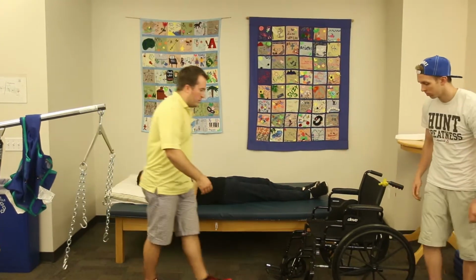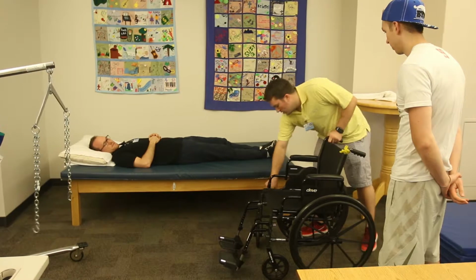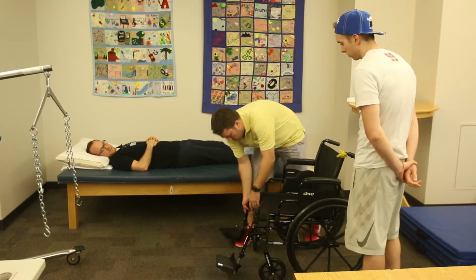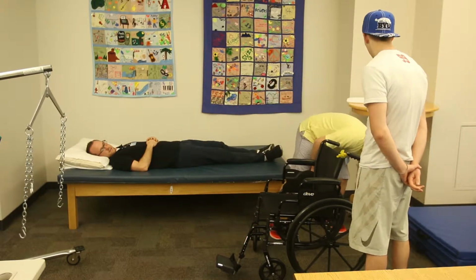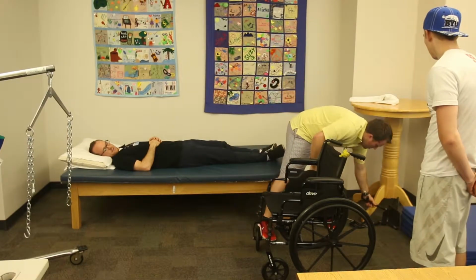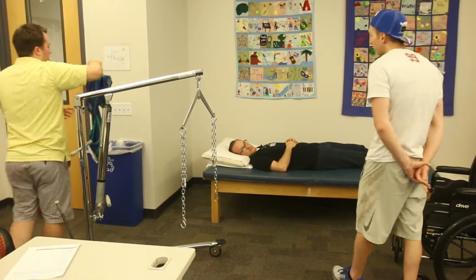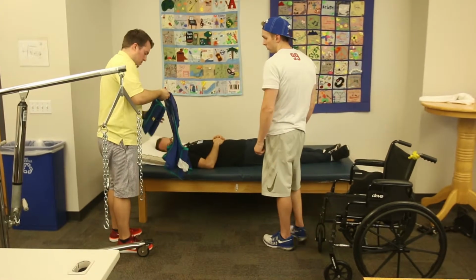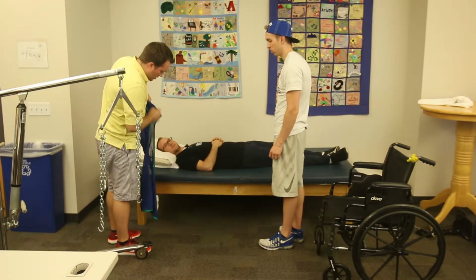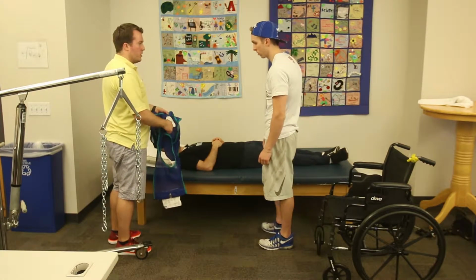Yeah. Perfect. Let me go ahead and make sure that everything's set up just the way we want it. Get these out of the way for now. Alrighty. So we're going to put this harness underneath you to be able to use the lift. What we'll do is we're going to situate it like this so that this hole is going to just hold his rear end. We're going to make sure that these seams are away from the patient's skin.